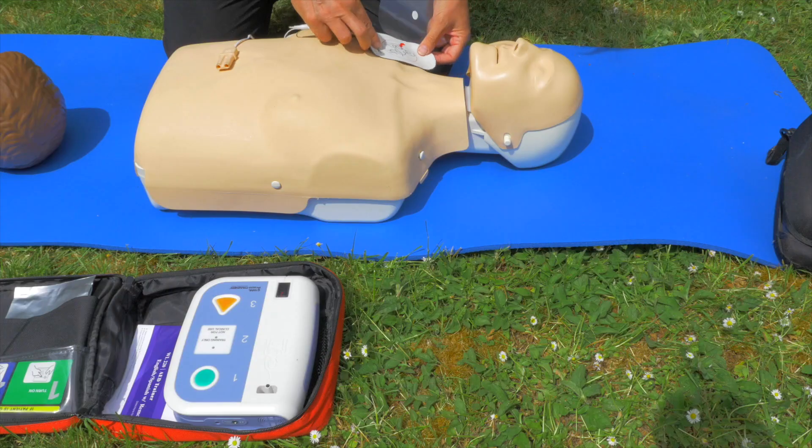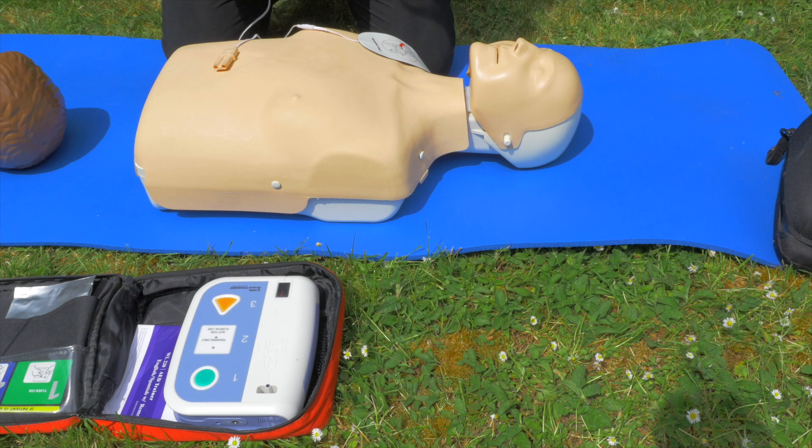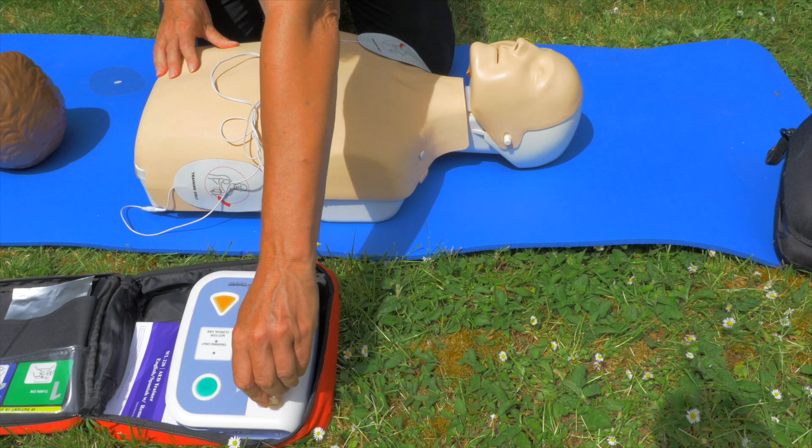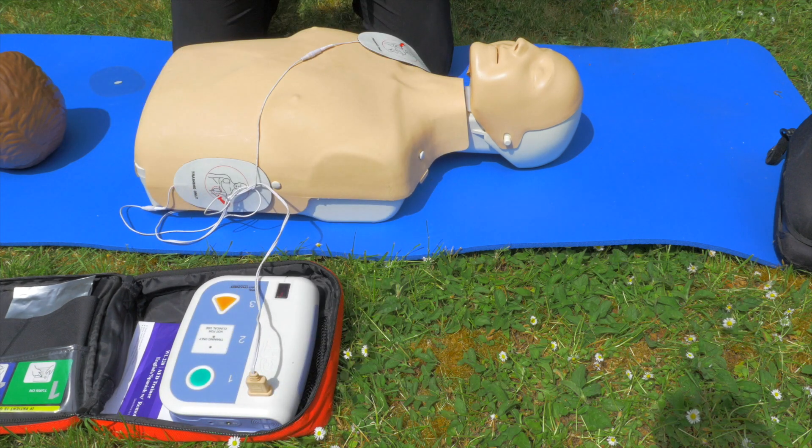The first pad goes on to the right-hand shoulder. The second one comes down to the side on the left. With this trainer unit we also have to plug the connector in.